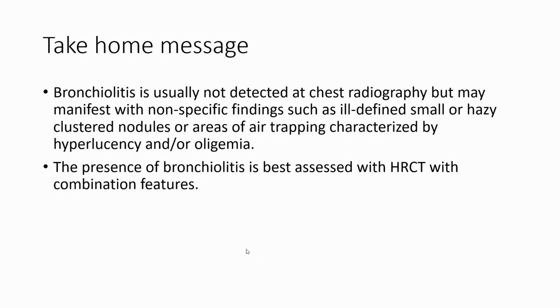Take home message. Bronchiolitis is usually not detected in chest radiography, but may manifest with non-specific findings such as ill-defined small or hazy cluster nodules or areas of air trapping characterized by hyperlucency and/or oligemia. The presence of bronchiolitis is best assessed in HRCT with a combination of features.